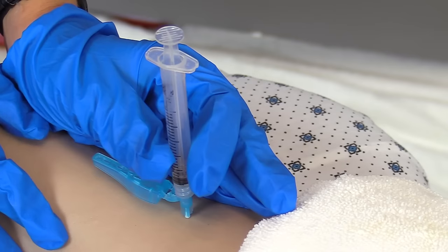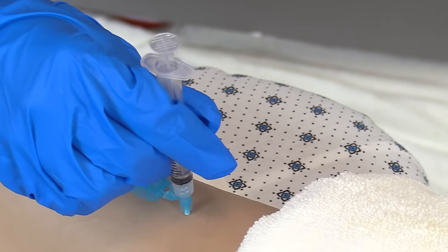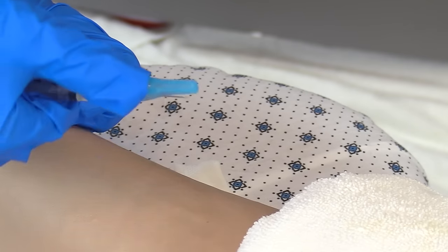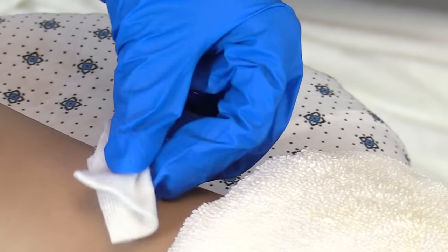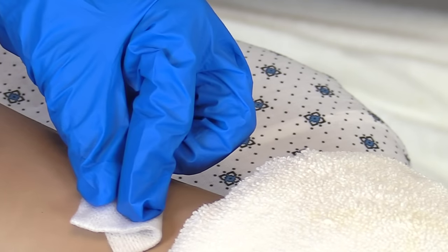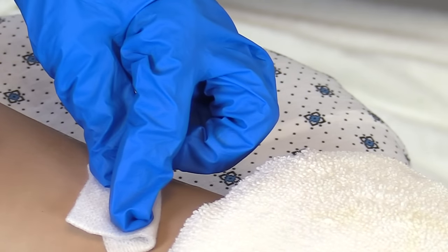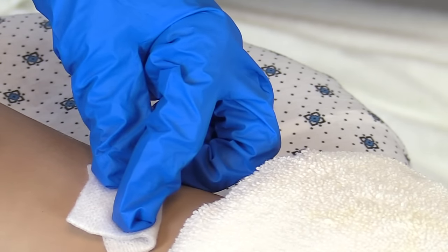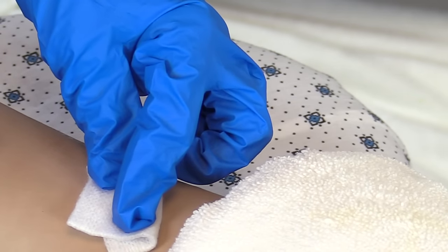Remove the needle at the same angle you inserted it, then engage your safety. Never recap a used needle. You can take a gauze and cover the area — sometimes it can bleed if your patient is on blood thinners. Never massage the area because that can increase the solution going into the sub-Q tissue. Then dispose of your syringe and needle in the sharps container.